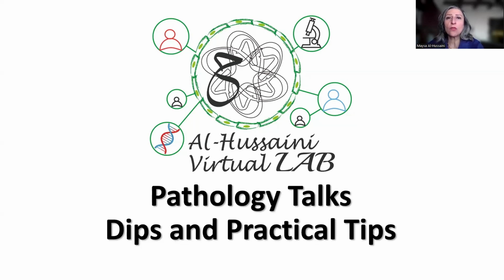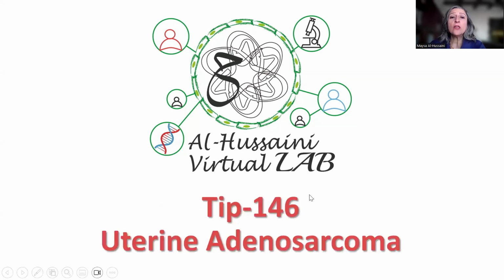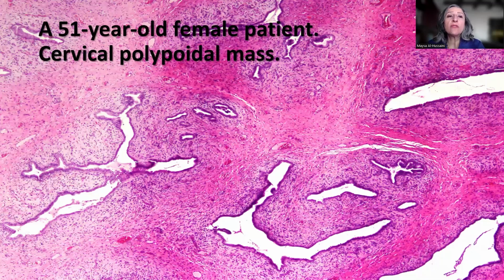What I'm going to be sharing with you today is a nice example of a rare tumor that can have potential pitfall. This is a case of uterine adenosarcoma. So this is a case of a 51-year-old female patient who was discovered to have cervical polypoidal mass. So the cervical polypoidal mass was excised.